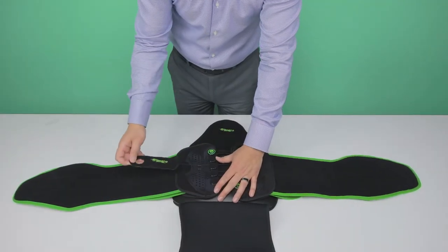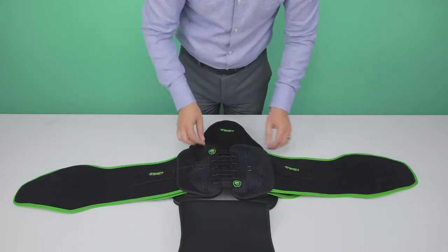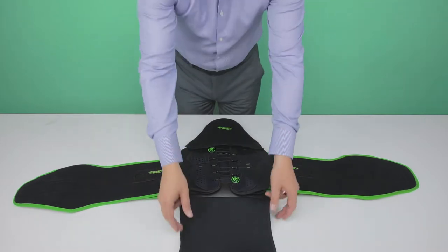Turn over and place the pull handles back to the starting point. Close the back cover onto the rigid posterior panel.